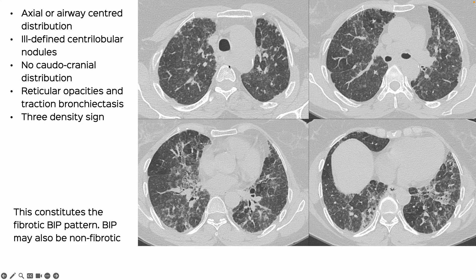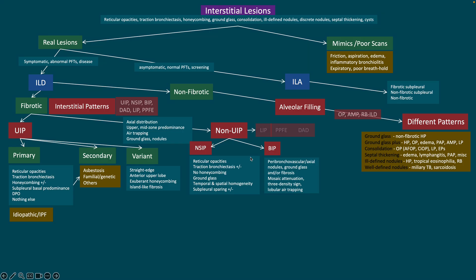If you look at this patient, we have the axial, or airway-centered, disease pattern. There are ill-defined centrilobular nodules, no real craniocaudal predominance. You have reticular opacities, traction bronchiectasis, and the three density sign — and this constitutes the fibrotic BIP pattern. BIP may also be non-fibrotic. Using the unified approach, in this case we say: yes, there are real lesions, it is an ILD, it is fibrotic, it is non-UIP, and it fits into the BIP pattern.